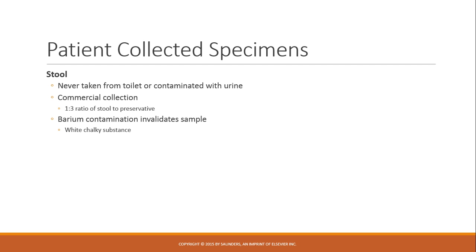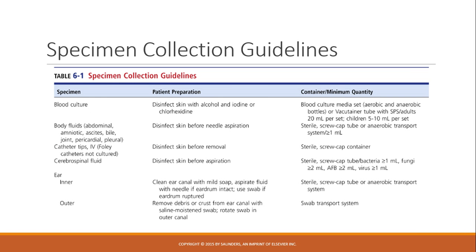And commonly, the stool samples are placed into different preservatives. There may be 3 to 5 different vials in a stool kit, and you'll separate out the stool into each of those vials. And they each do something different. One might be for a bacterial culture. One might be for ova and parasite exam, a microscopic exam, so it preserves the morphology of eggs and worms that might be in the stool. Another one might be for immunoassay testing, or Clostridium difficile testing. So it just depends on what the doctor's looking for, and we'll take a look at some of those containers in the lab.